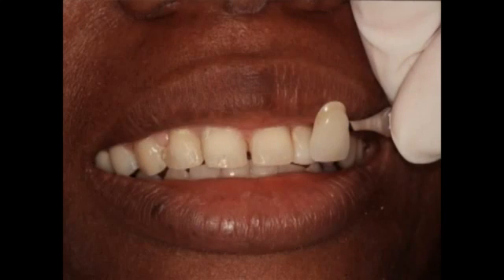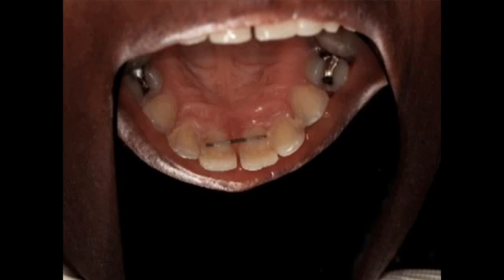This patient was referred to me for porcelain laminate veneers. She's an adult patient. She's had orthodontics to close the diastema between 8 and 9. The diastema opened up. She had adult orthodontics again to close it up. And then they even splinted this case, and the diastema opened up again.